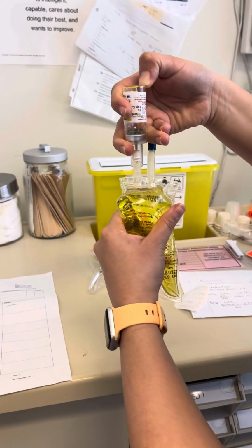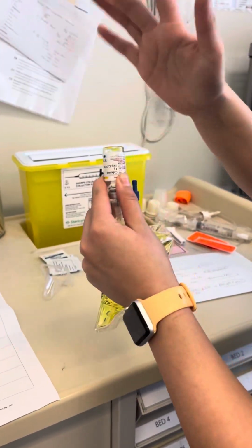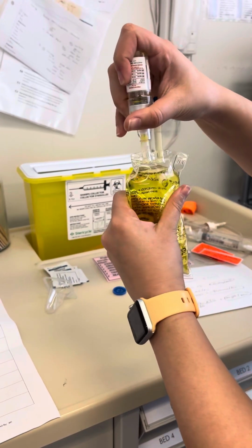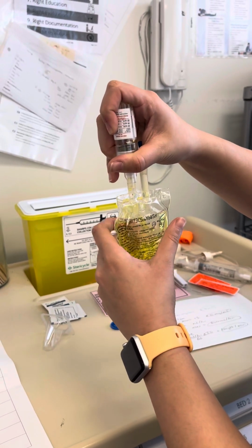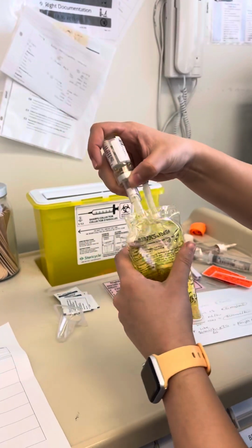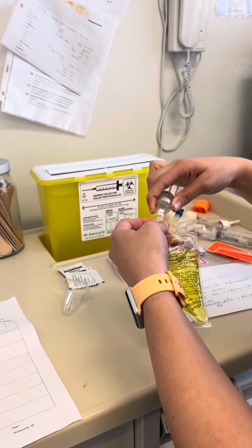I'm gonna make sure I try to get all of the medication in there. Okay, that's good enough. So we're gonna take this off.